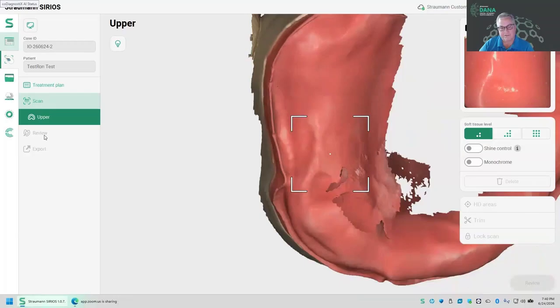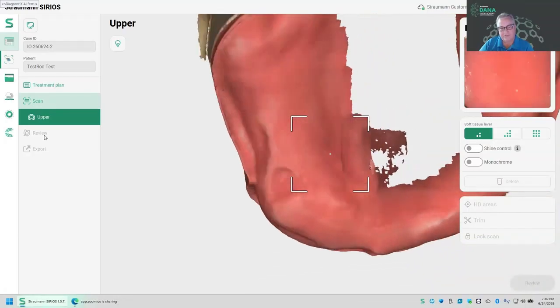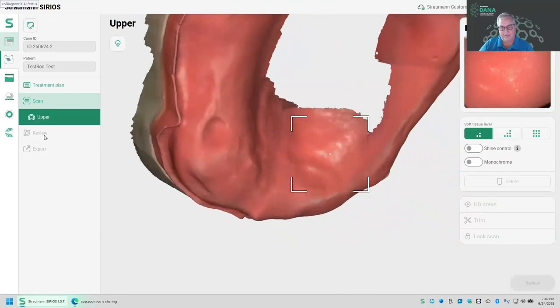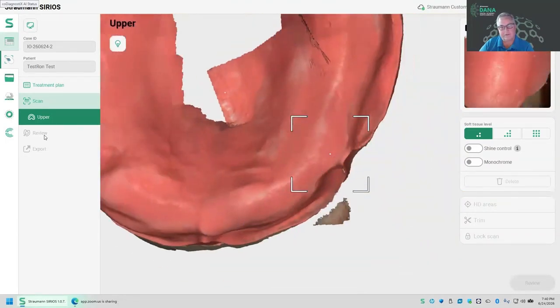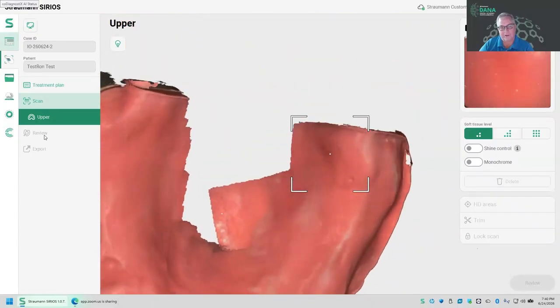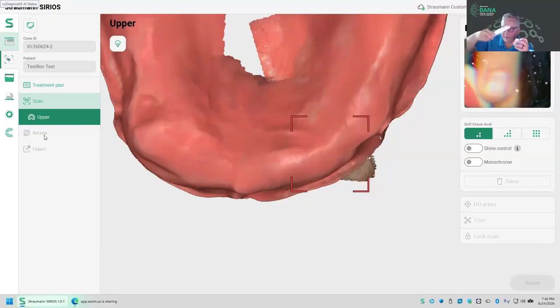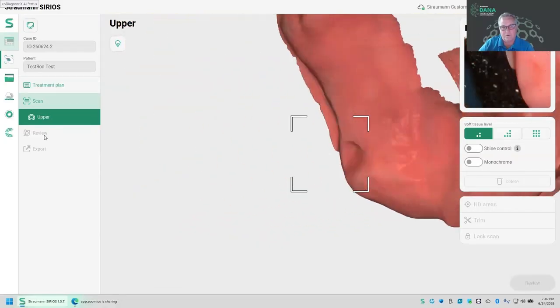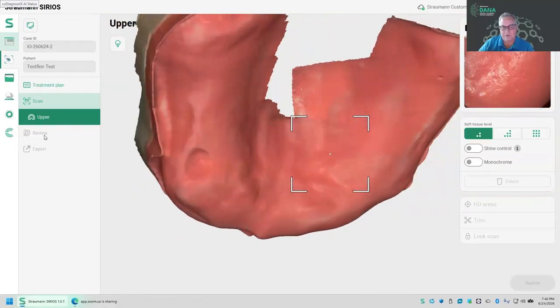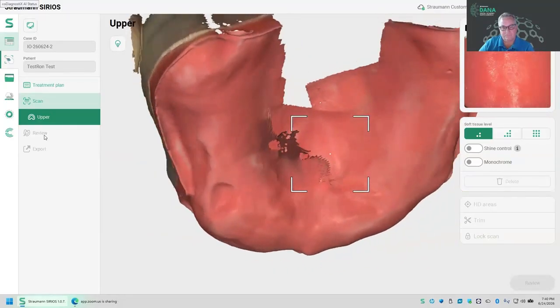It's edentulous, so the software is a little bit more challenged in building it. All right. And come around. Okay, starting again to go off. Let's come back to the occlusal. All right. And now, of course, building the palate, same technique. We're going to start going across from one side to the other, starting in the anterior. So I'm going to go across here from one known surface to the other, come back around, one known surface to the other, and fill in as I go.